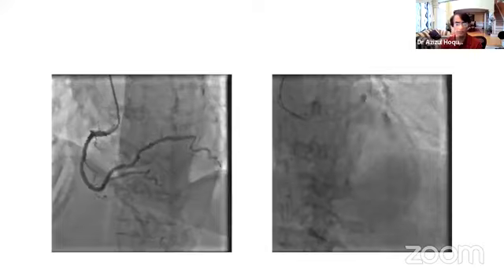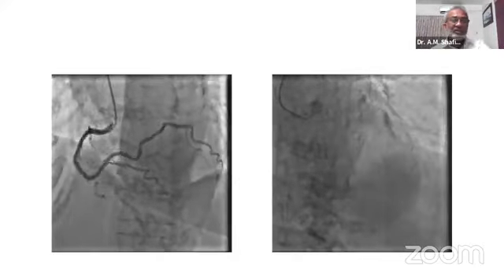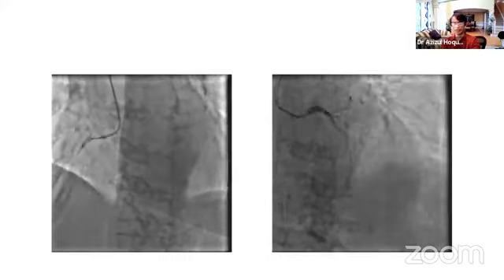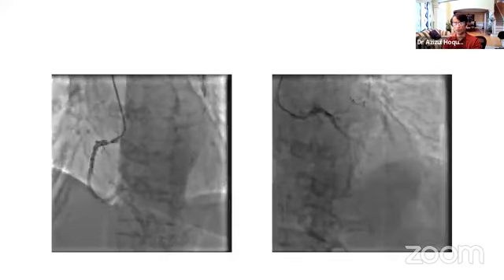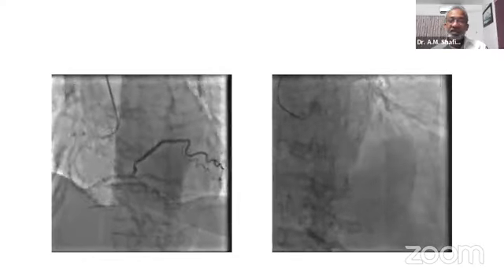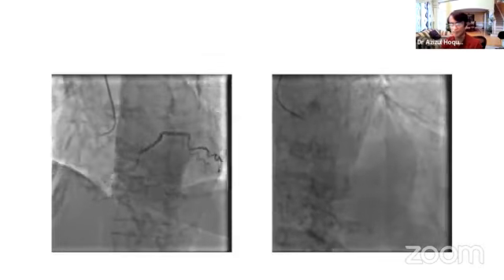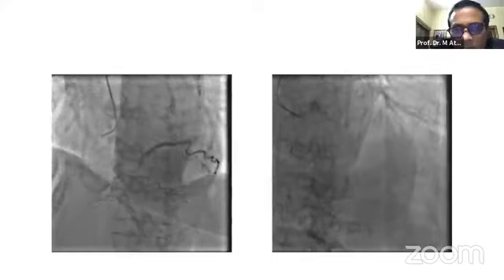Okay, that's interesting. I have the pictures of the echocardiogram as well, but not uploaded here. The reason is I'm looking at the LV on the coronary angiogram right now. I see how the heart is moving. It looks like the patient has some sort of cardiomyopathy because the heart is not really squeezing well. But diastolic dysfunction is there, and systolic dysfunction is not there. Yeah, but the shadow is not moving vigorously. Okay, it's not an LV gram though. I agree.